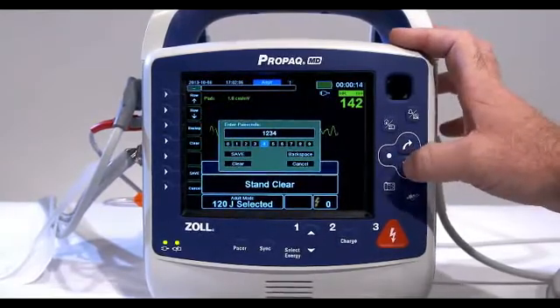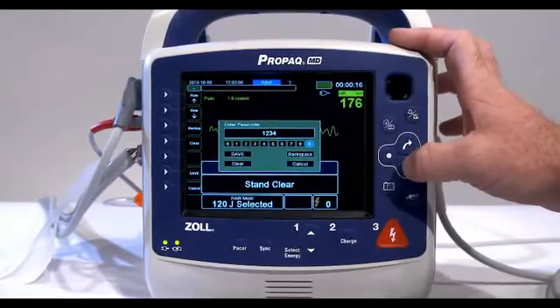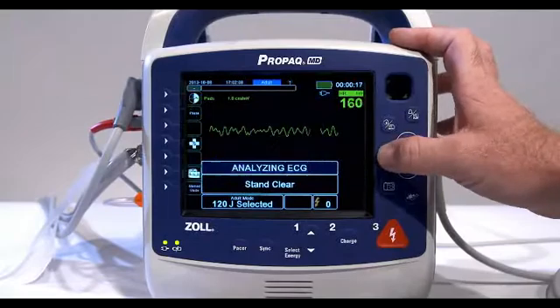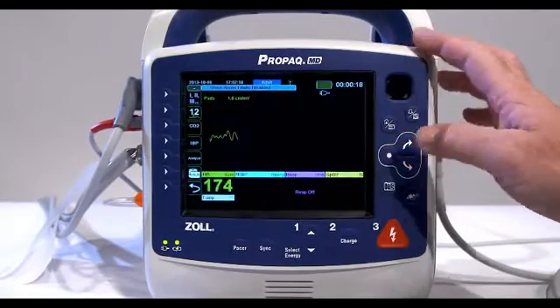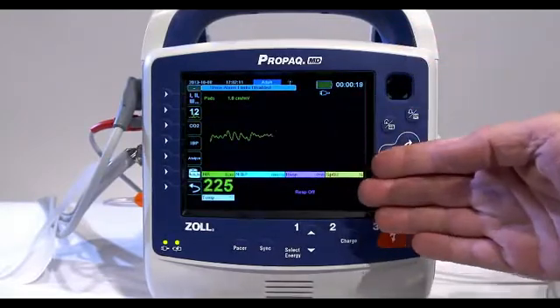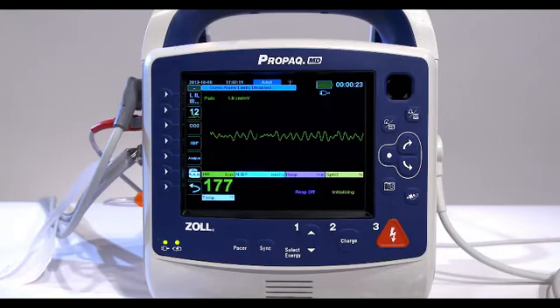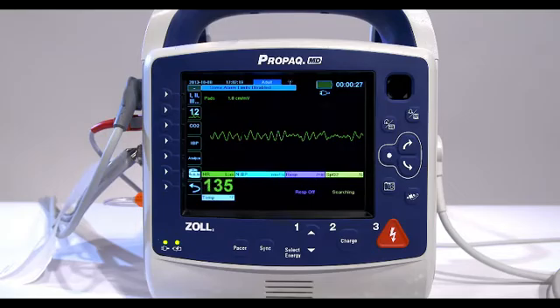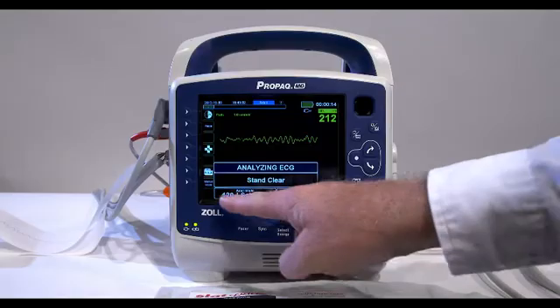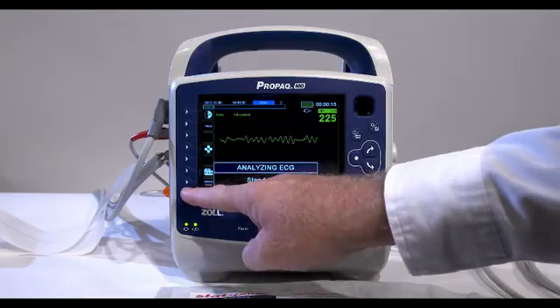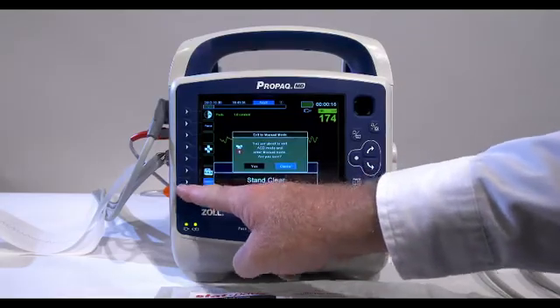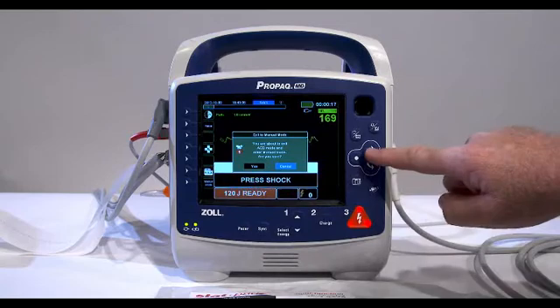Once you have entered your passcode, you will be able to enter manual mode. When changing from AED mode to manual mode, the current selected energy level is maintained. If the unit has not been configured to enter a passcode, the message 'Exit to Manual Mode' is displayed.